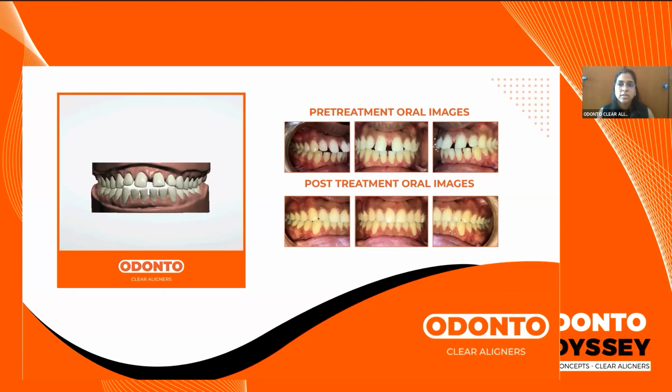So what we do is we have a set standard of 0.2 millimeters per aligner in terms of linear movements. That will be either buccolingual, that's facial movements. In case of rotations which are present, then it will be 2 degrees which is placed. So 2 degrees and 0.2 millimeters of movement is programmed per aligner.